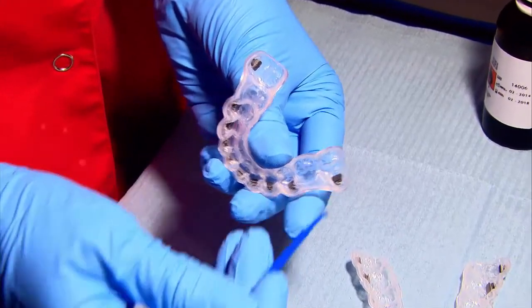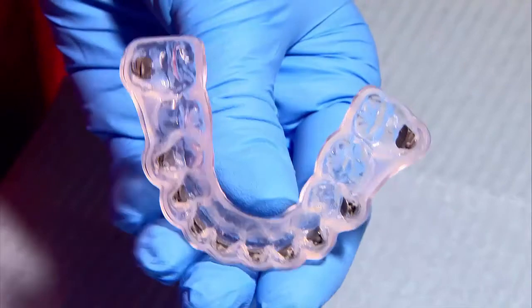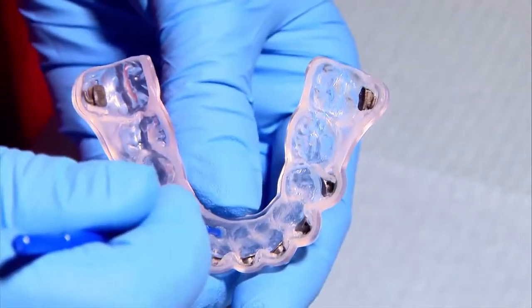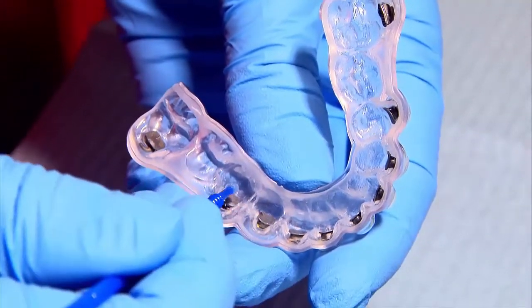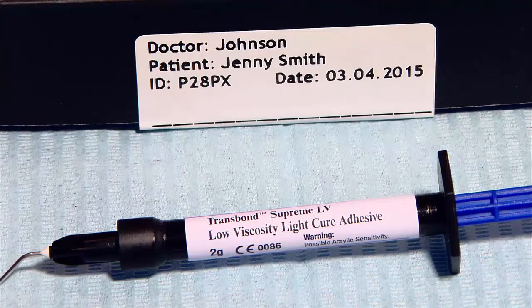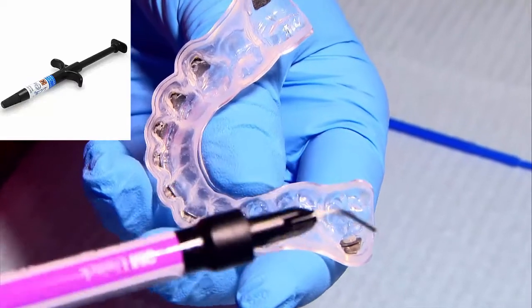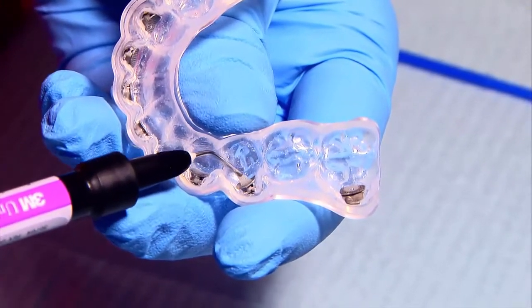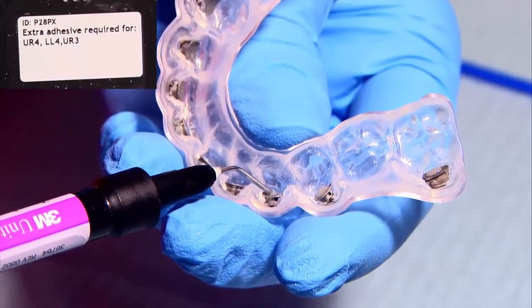To begin preparing the trays, dip a microbrush into an alcohol-based sealant and dab the back of each bracket lightly. Do this for both trays — one dip easily covers 3 to 4 brackets. Next, apply 3M Transbond Supreme Low Viscosity or Reliance LCR on all bracket pads. Use only a small amount to prevent flash, unless indicated differently in the extra adhesive instructions.